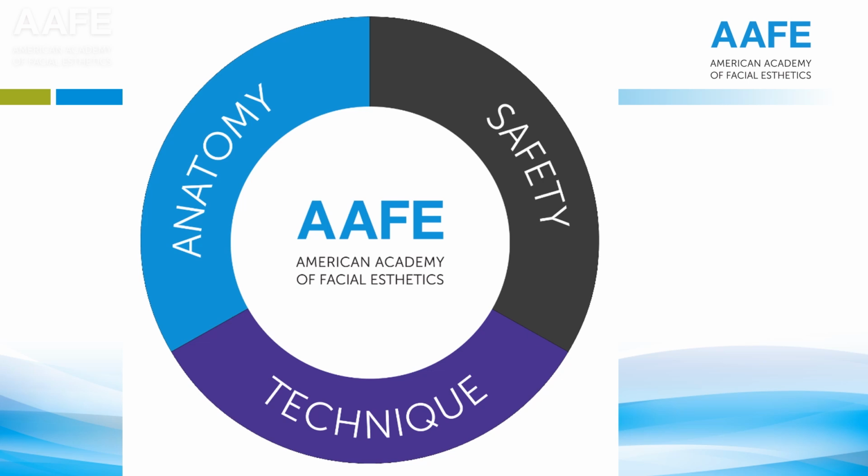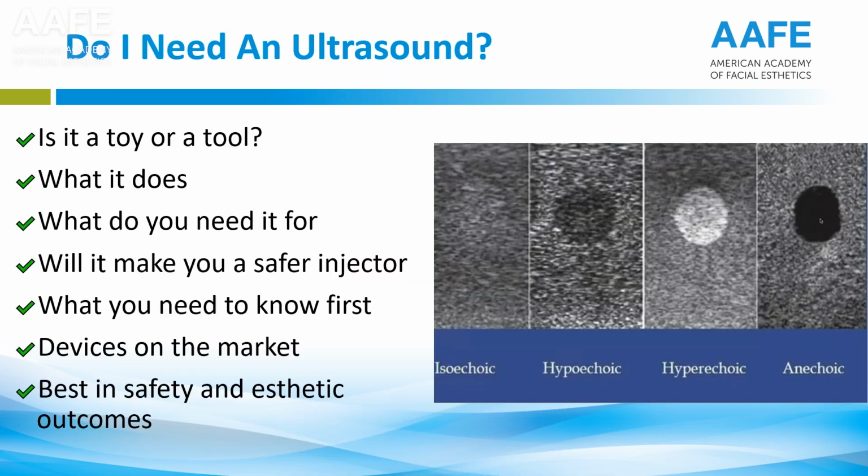So let's take a look at the questions. The question is, do I need an ultrasound? Is it a toy or is it going to be a tool? Do I really need one if I'm doing injectables in my practice, or more specifically, dermal fillers for sure? What does it do? We're going to cover all this. What do you need it for? Will it make you a safer injector? I'll let you decide so you can know the real truth about ultrasound and facial aesthetics.